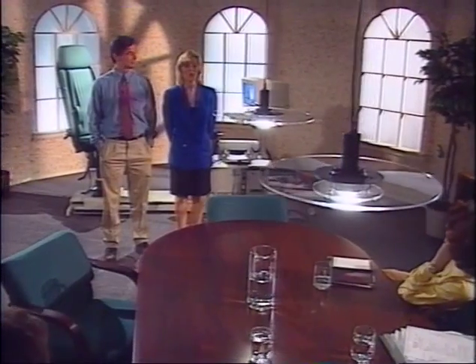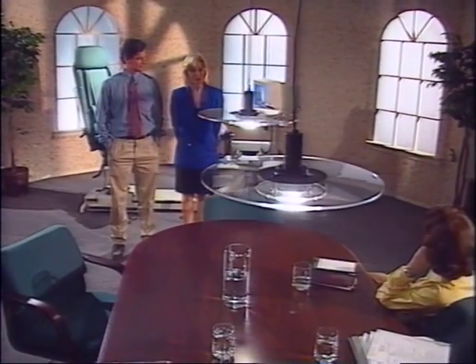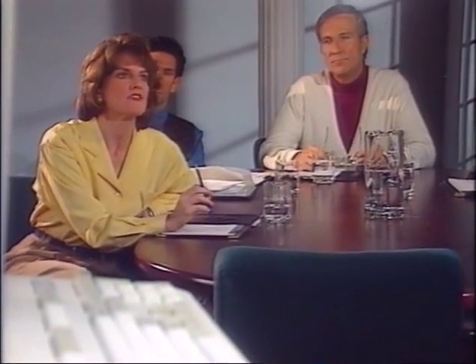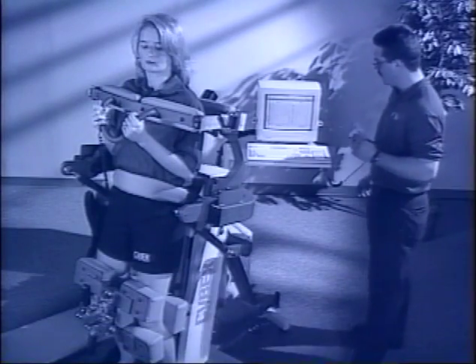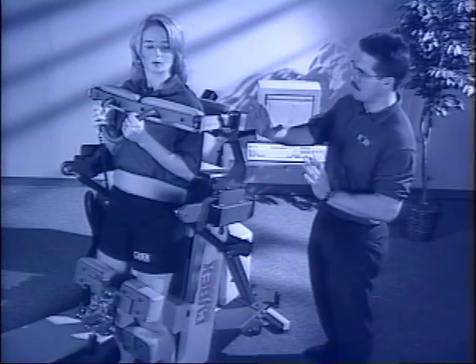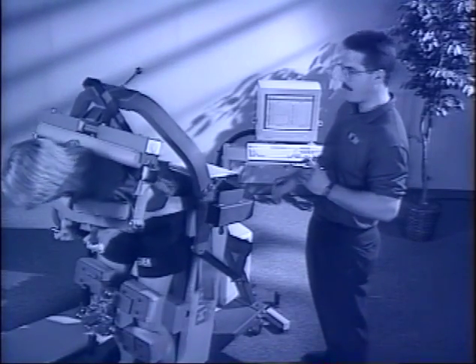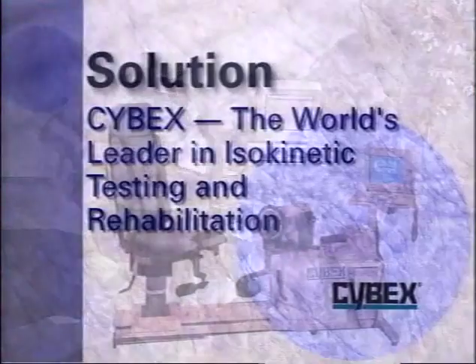Are the test exercise patterns we've seen included in the price of the system? Yes, all setup patterns come standard on NORM. Yeah, I'm curious. What about the CYBEX TEF modular component? Can it be used with NORM? Absolutely. The TEF modular component is designed to adapt to the NORM system and can be installed on the left or right side of the system.